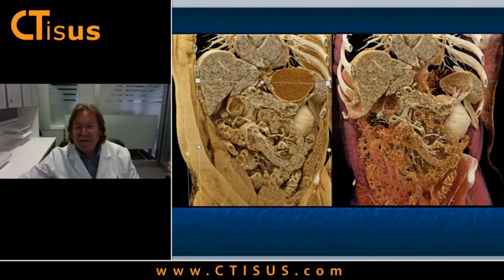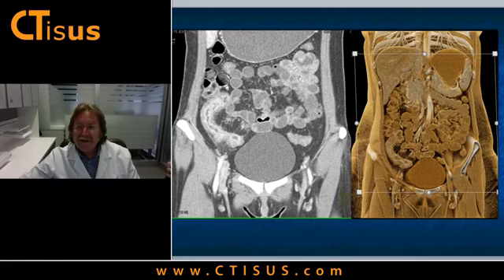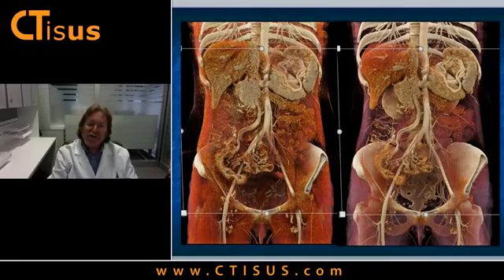We've been looking also at small bowel when Linda finishes this. You can see here the terminal ileum, prominent thickening and enhancement, active Crohn's disease. You can see the coronal of that, and you can see the cinematic rendering appearance with the prominent enhancement of the patient's bowel. And here it is again as I change the parameters. Look how I can accentuate the vessels, the ileocolic branches to the patient's ileum, but look how you can see the inflammation of the terminal ileum, very nicely seen.